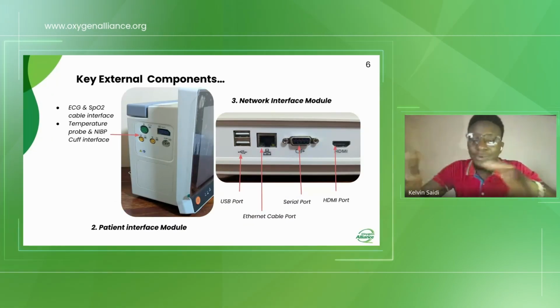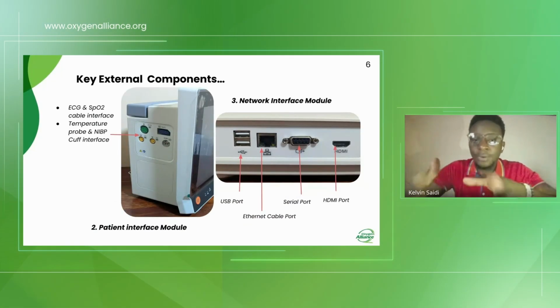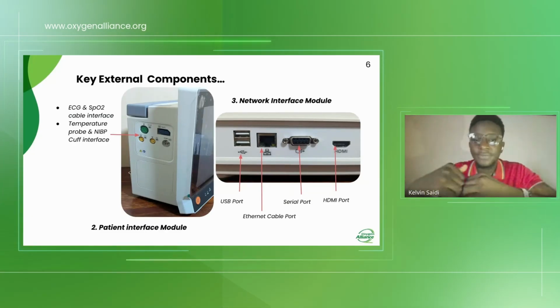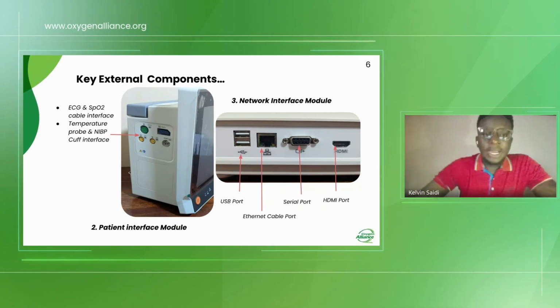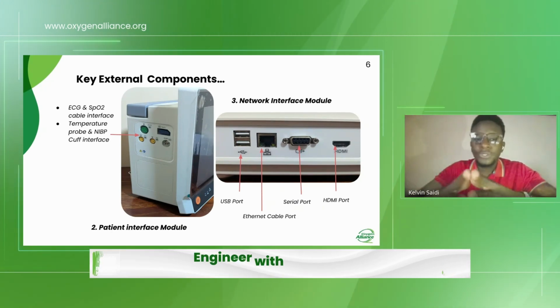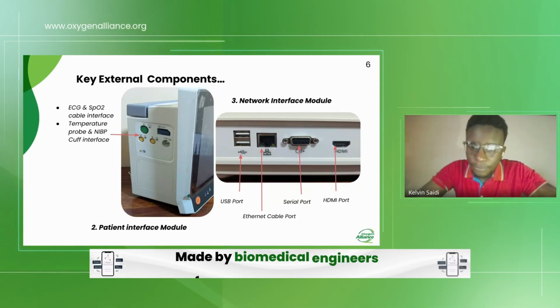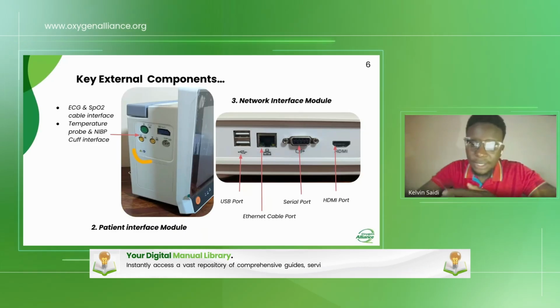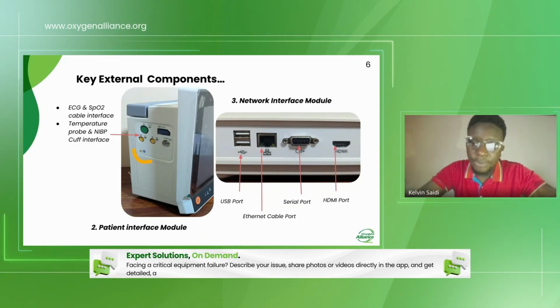So let us now look at the patient interface module. So this is where all the sensors and leads are connected from the patient side to the device for processing and displaying. As I was saying, they consist of well-labeled ports for each parameter that the monitor can support. So from this image here, you can see it is well-labeled: ECG, temperature T1 and T2, SpO2, and NIBP.